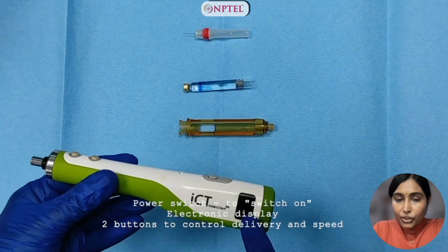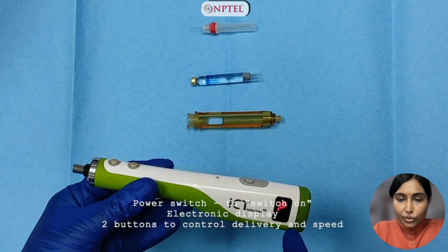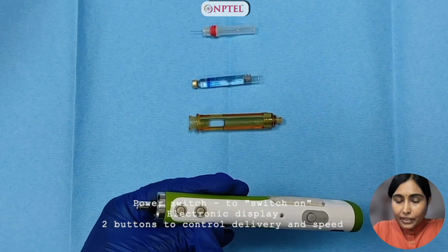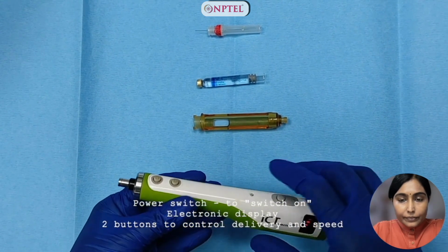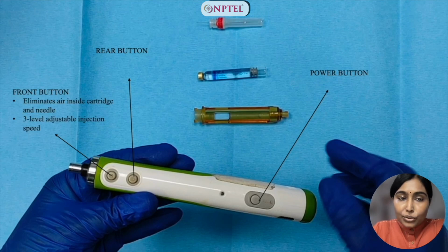It has a power switch to switch on. That's the switch. It's being switched on, and you see an electronic display. And there are two buttons in the front to control delivery and speed. Now a closer view of all these buttons. The front button is used to eliminate air inside the cartridge and needle. It has 3-level adjustable injection speed, and the rear button is for temporary pause of injection and to initialize injection. This is the power button for on and off.